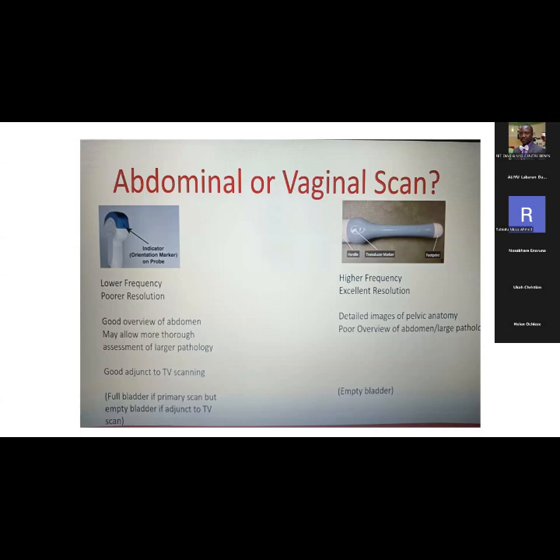So you will have to do it without filling the bladder, because what you're examining for at this stage is actually in the abdomen, not necessarily in the pelvis. So getting to see it will not require filling the bladder. So when you do a transabdominal scan as an adjunct, you usually don't have need to fill the bladder. It will not require a full bladder.